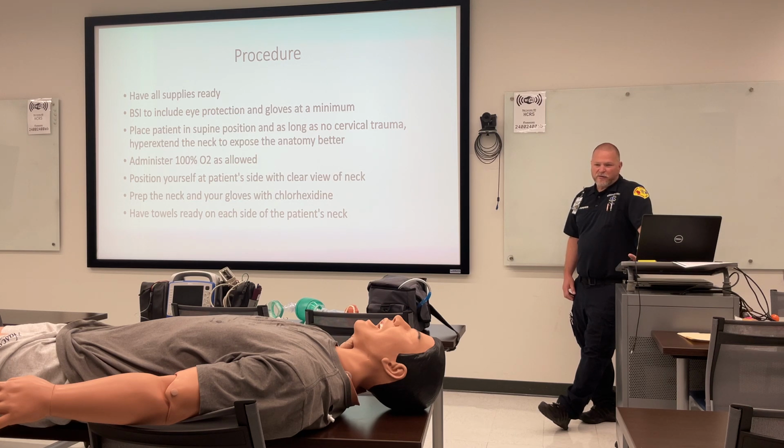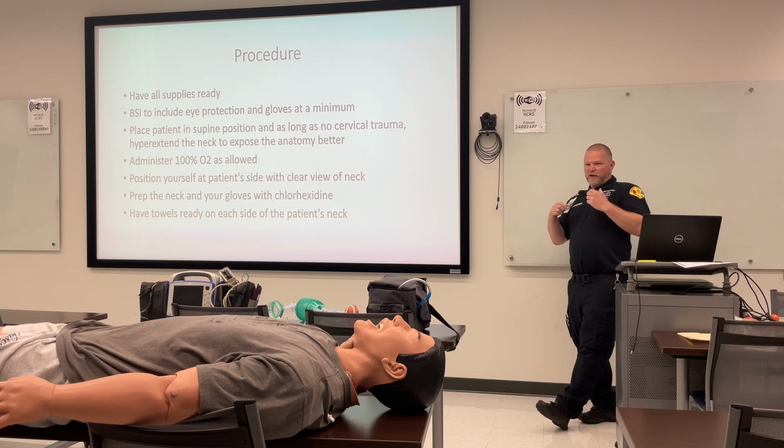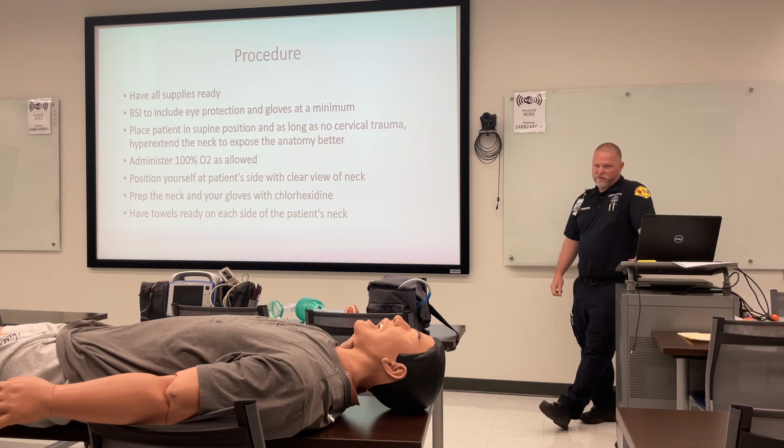I always recommend when you're prepping the neck for the surgical cric with your chlorhexidine or your betadine, to do the fingertips of your gloves, of what you're gonna be touching and holding, because if you clean the area and then you put something dirty on it, you're just defeating that whole purpose. So if you go ahead and do your fingertips at the same time, you'll be good to go. And I recommend having some towels prepped and ready, next to the patient's neck. That way you can stop any bleeding that may occur.